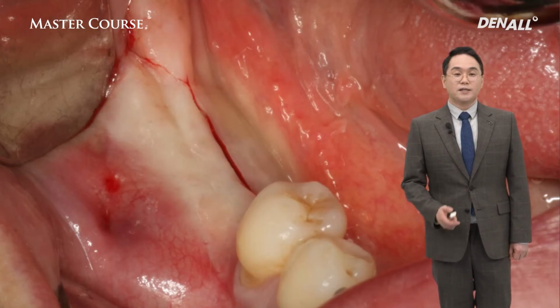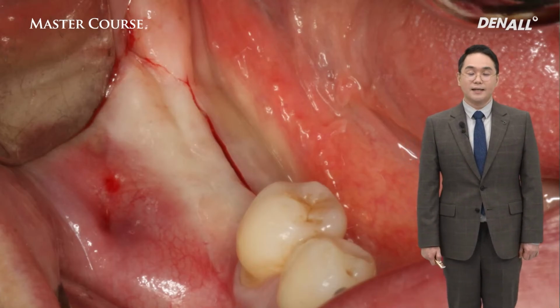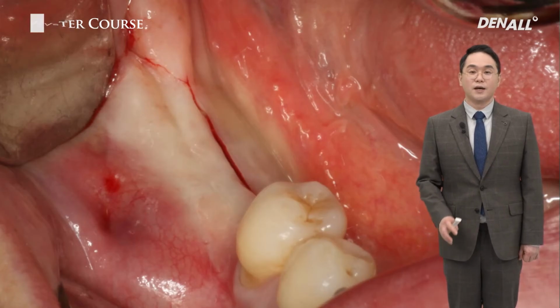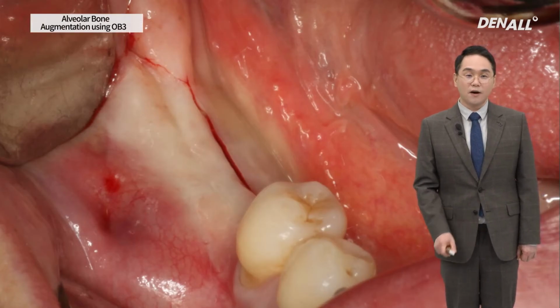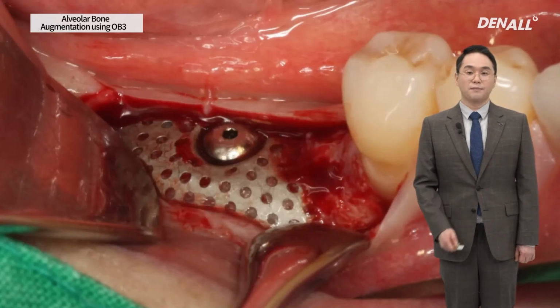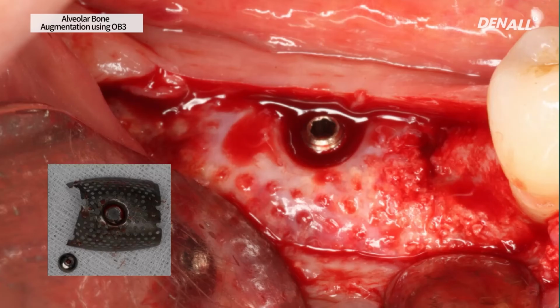To remove the Jawbuilder, only horizontal incision, crestal incision is made, not vertical incision. As I said before, to fix the Jawbuilder, only a cover cap is used. The flap is raised and the cover cap that fixed the Jawbuilder is removed, and the Jawbuilder is removed. As you can see, the ideal bone is regenerated buccally and lingually just in the form of the Jawbuilder. And vertically, bone is regenerated.